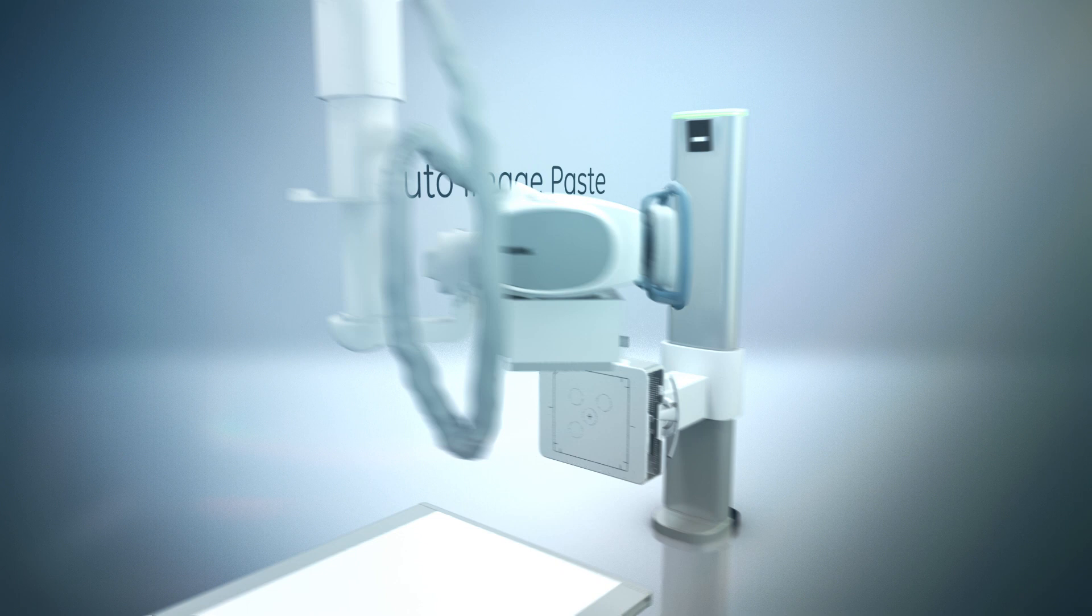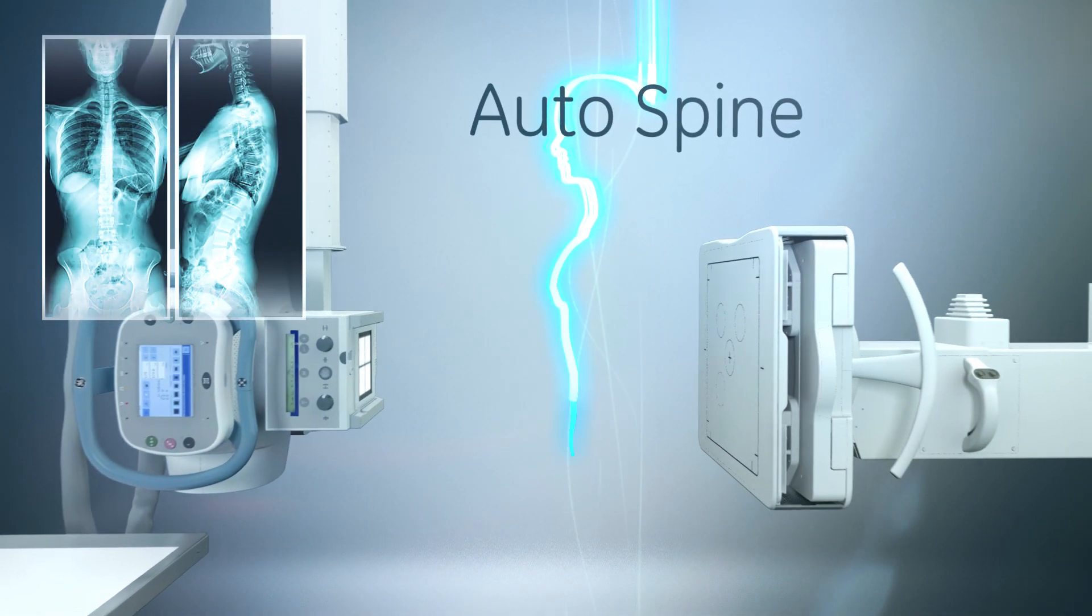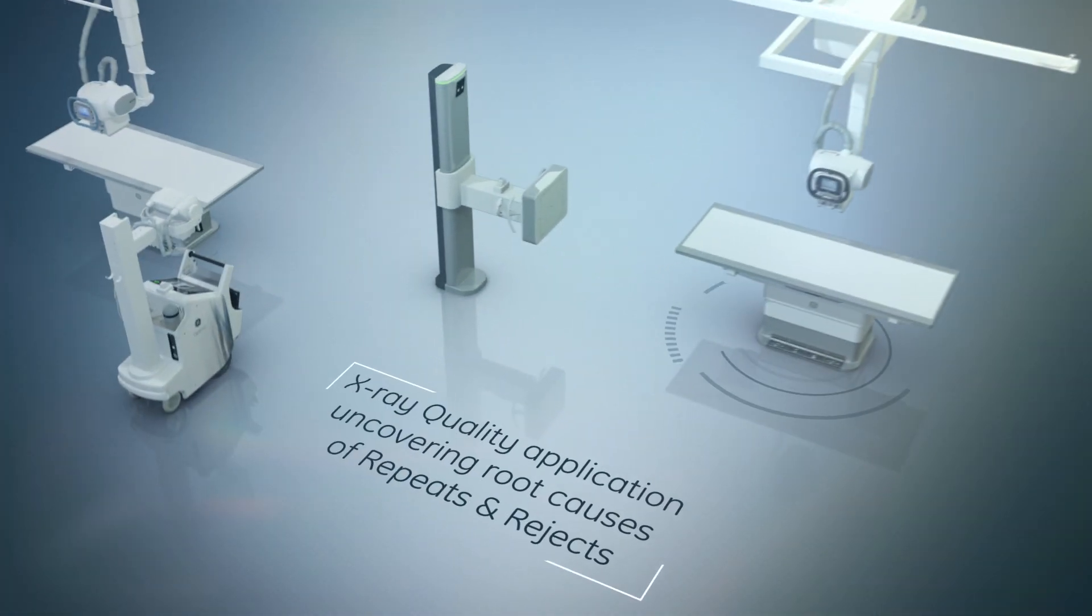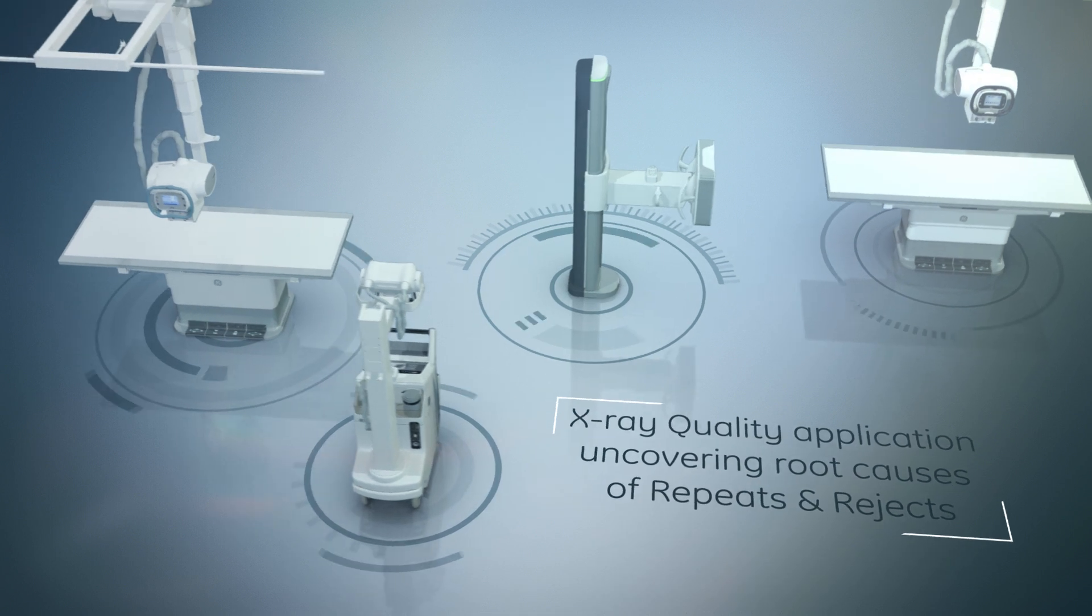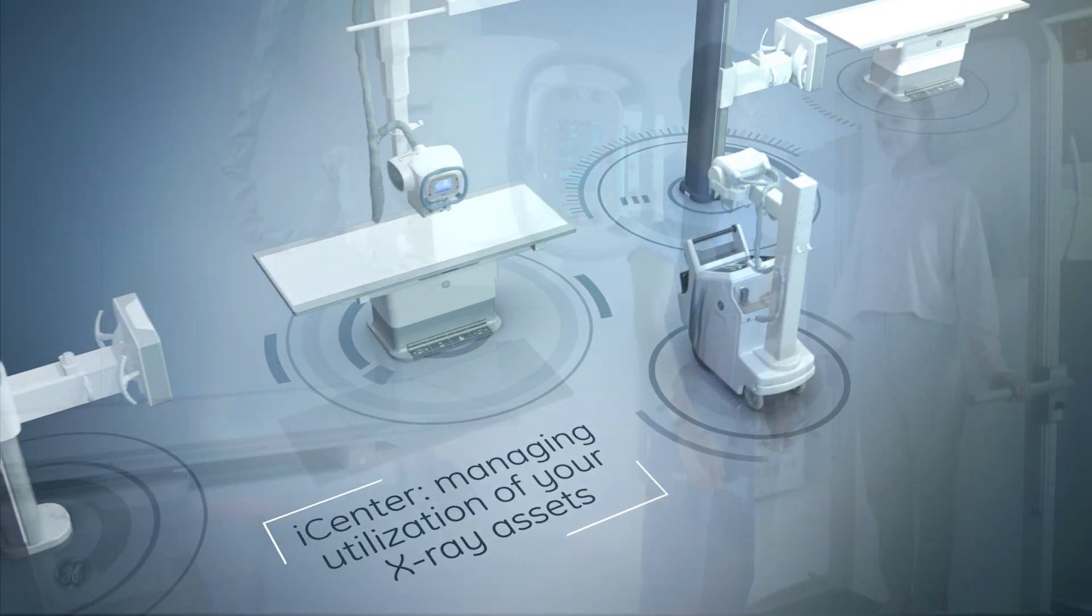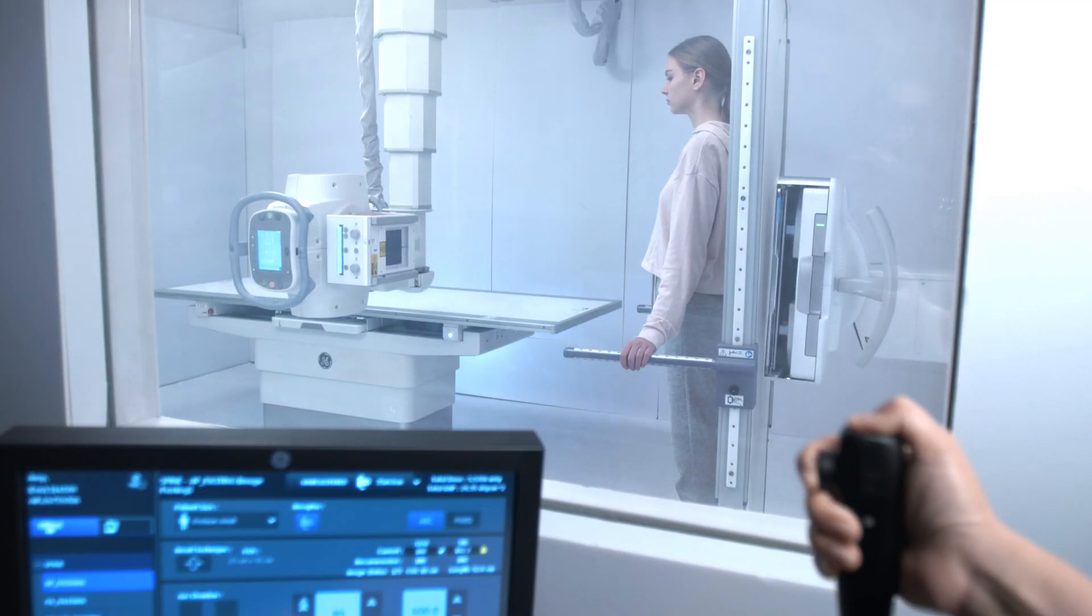Optima XR646HD is powered by Autorad, a comprehensive workflow automation suite, and supported by connected analytics and service technologies that never quit. Helping you improve the quality of care and efficiency of your radiology department.